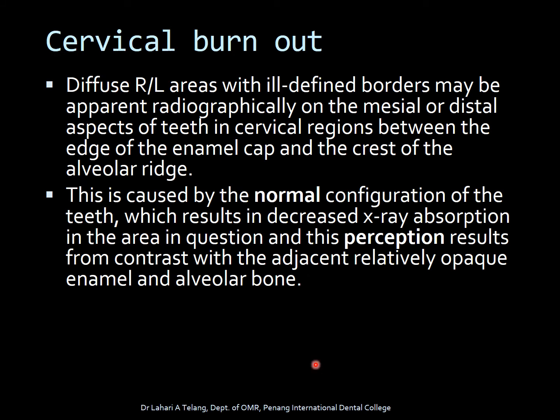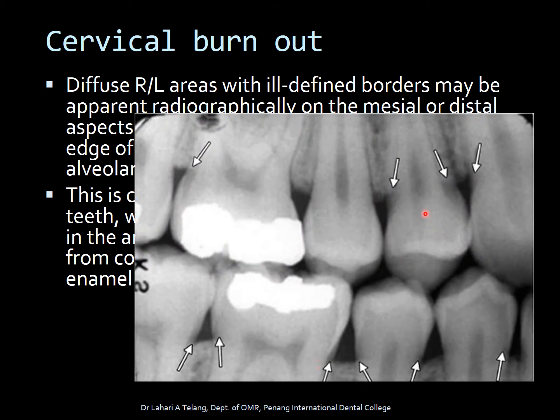There is an interesting finding called cervical bone burnout. It refers to diffuse radiolucent areas with ill-defined borders apparent radiographically on the mesial or distal aspects of teeth in the cervical areas, generally seen between the edge of the enamel cap and the crest of the alveolar ridge. This is caused by the normal configuration of teeth, which results in decreased X-ray absorption in the area. The radiolucent areas seen at the cervical aspect of the teeth are not actually caries but cervical burnout — a radiographic perception due to differential absorption of X-rays.